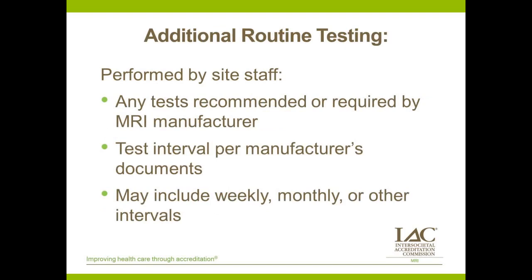Preventative maintenance is another category which sort of spans over into quality control. So preventative maintenance is typically going to involve a series of repairs or adjustments to the system that are done on a routine basis to try to keep the system operating at its best, performing correctly. As part of the preventative maintenance process, we expect that the service personnel are going to conduct a number of tests on the system to verify the system's performance.